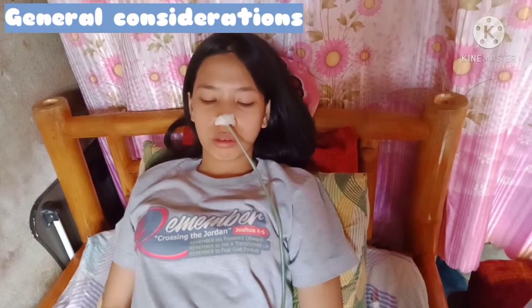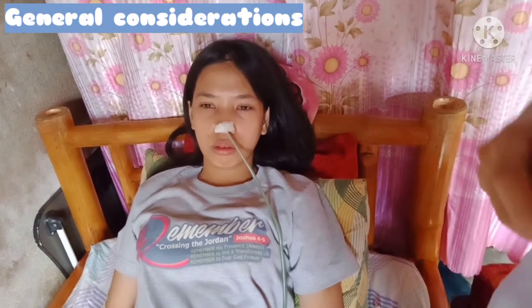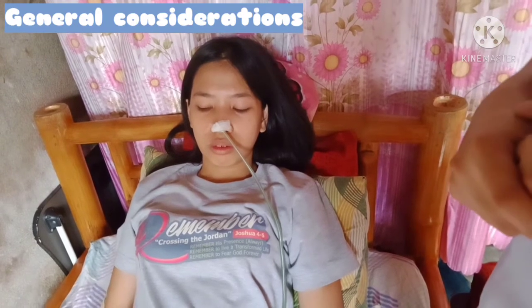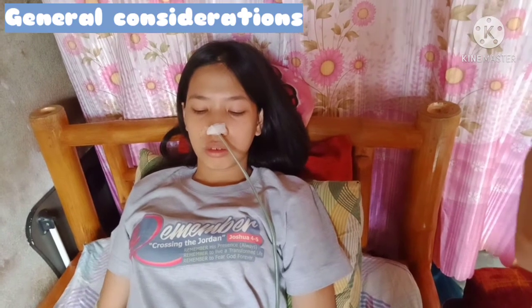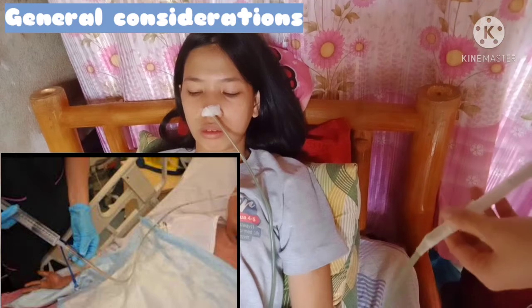For continuous feedings, plan pH testing at times when feeding may be withheld, such as for chest physical therapy, transport of the client for a test, or avoidance of medication interaction. Flush the tube with about 30 ml of air.